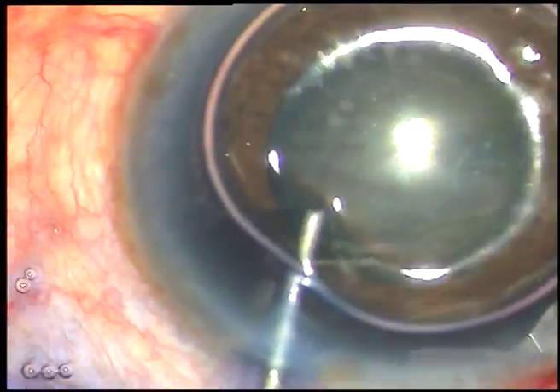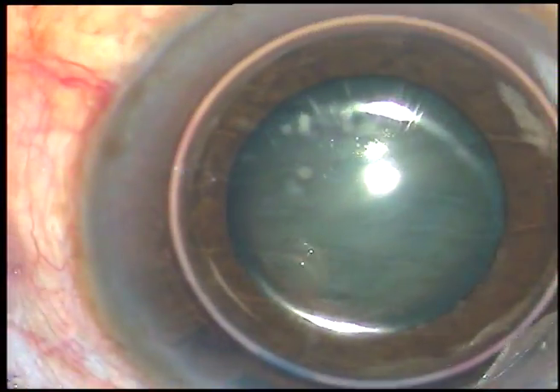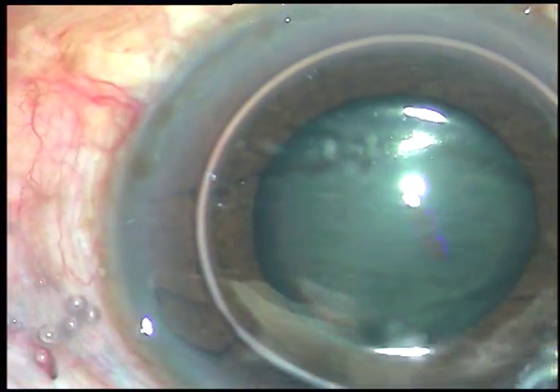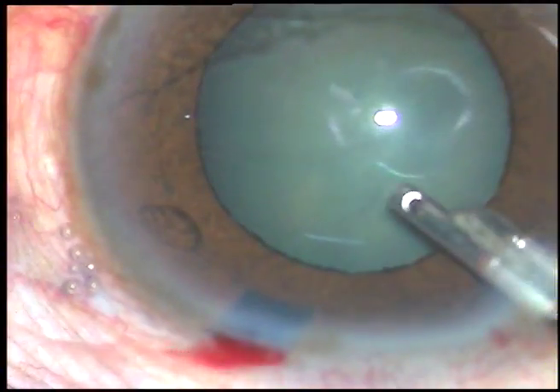This is a bit of adrenaline to see if the pupil dilates a little bit, but in this case the pupil didn't dilate well.